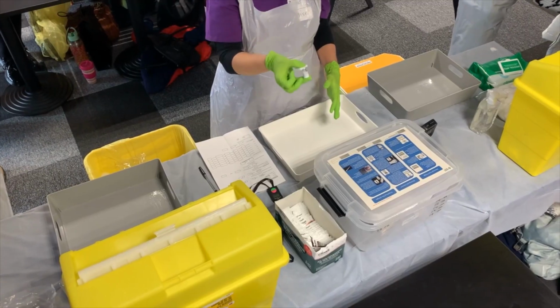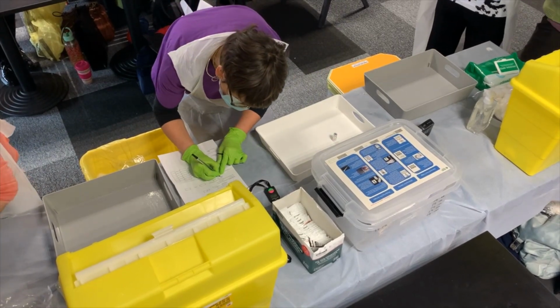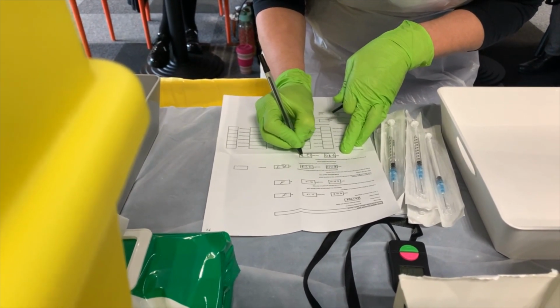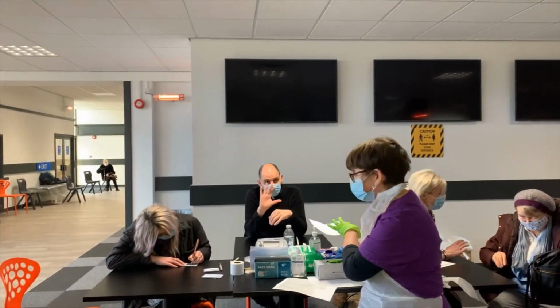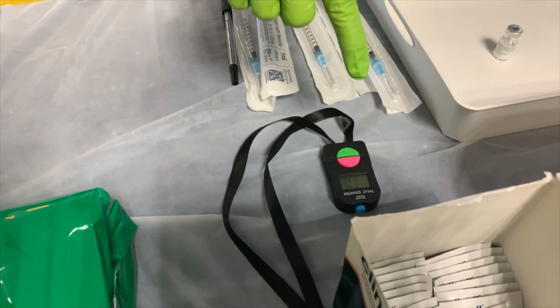Before starting to use each vial, mark the time and date that the vial was diluted. This is the start time of the 6-hour window that the vial needs to be used in. Be clear to inform the administrator each time a new vial is used. There is a clicker to keep track of each new vial used.